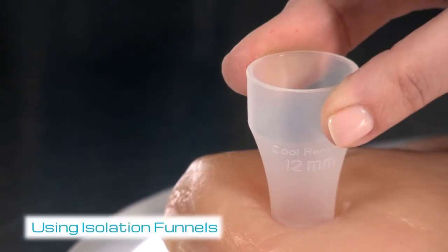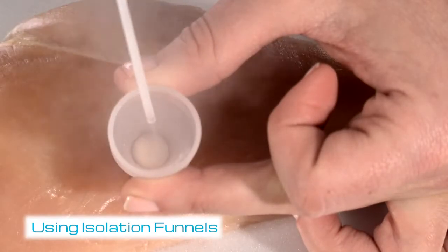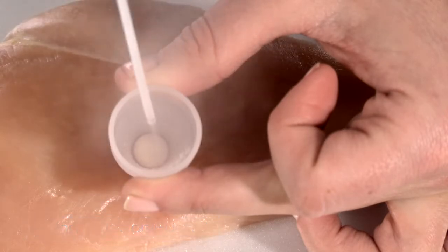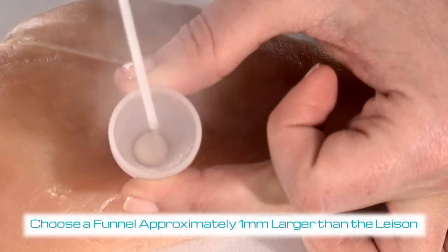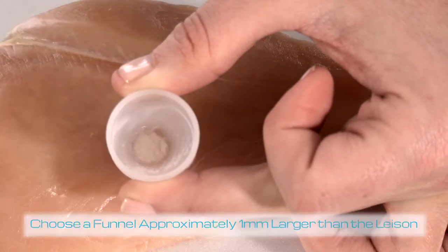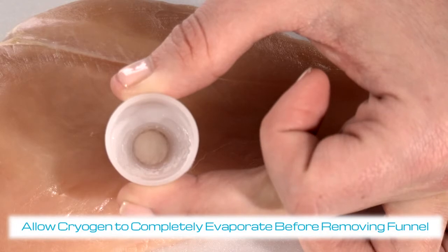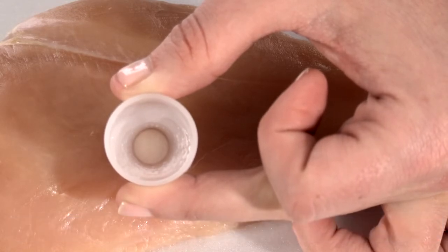When using an isolation funnel, position the subject for cryogen accumulation at the bottom of the funnel. If this is not possible, use the foam-tipped applicator. If you are using the isolation funnel, lightly spray the cryogen into the side wall of the funnel for 3 to 6 seconds to achieve 1/8th to 1/4th of an inch of accumulation.